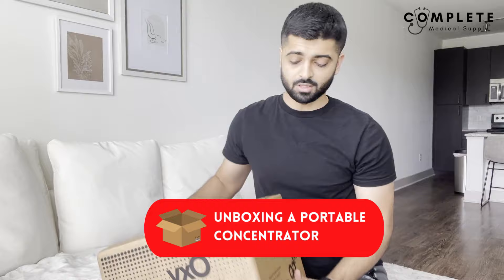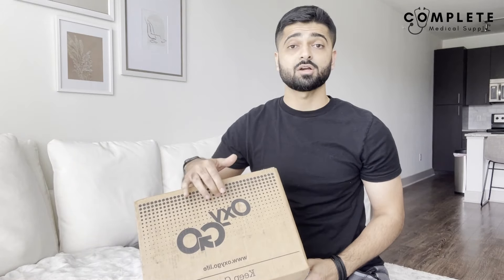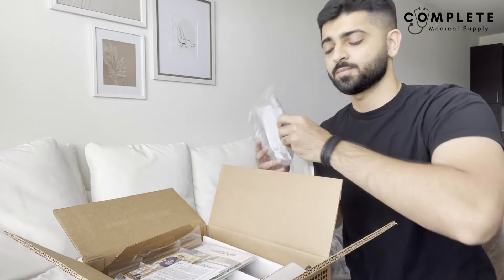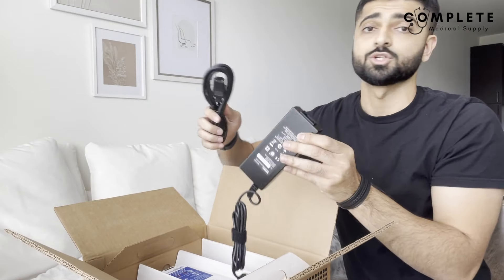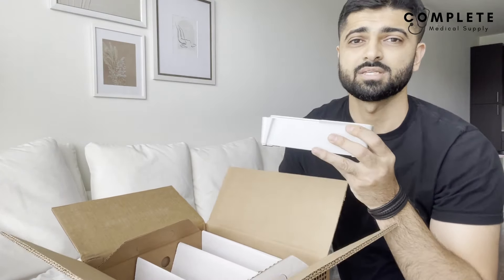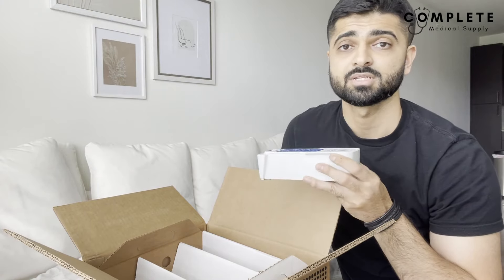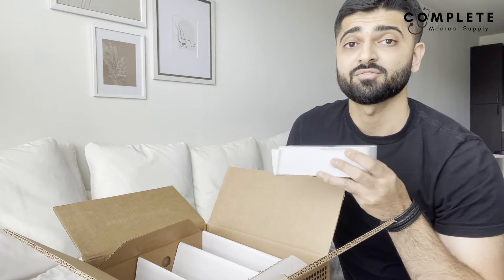This is what a portable concentrator box looks like — fairly small but weighing around ten pounds. This is the OxyGo Next, their newest machine, going from one to six liters per minute. Inside we have the nasal cannula, manual, a car charger, and a home charger to charge the battery. We also have the battery itself — this one is a double battery, which gives double the battery life of a single. When buying a portable unit, ask what type of battery you're getting and the difference in price.